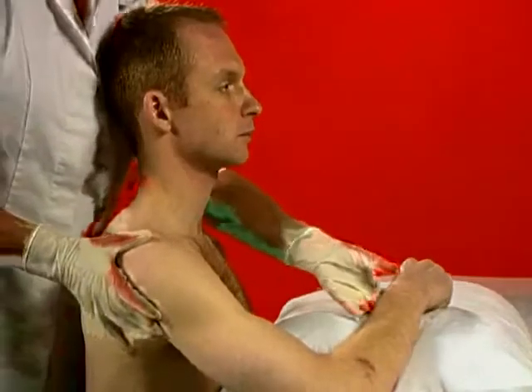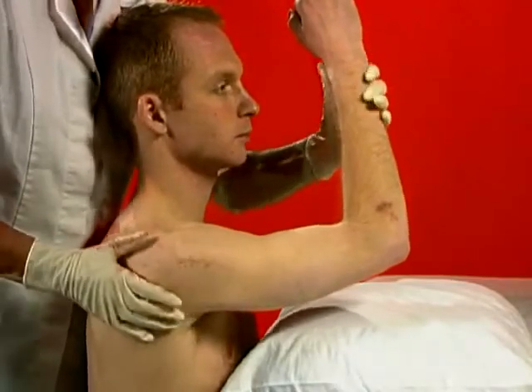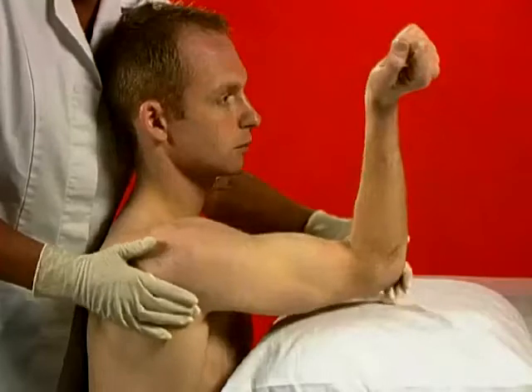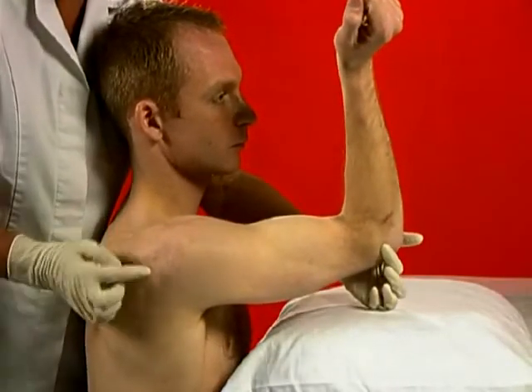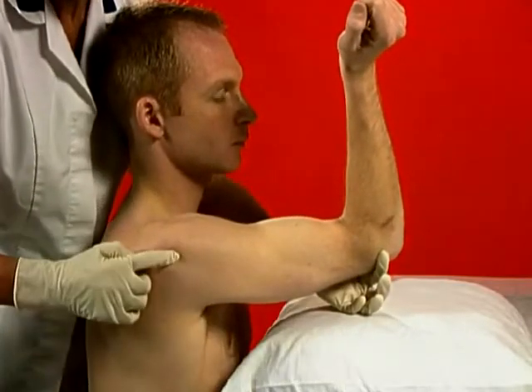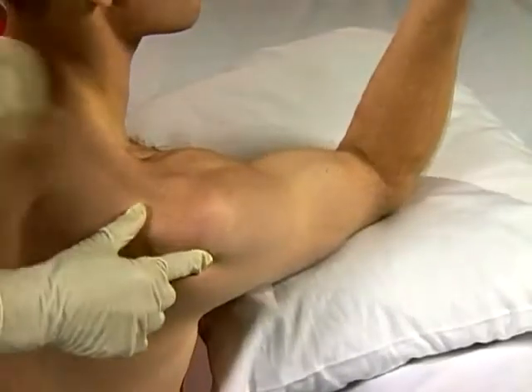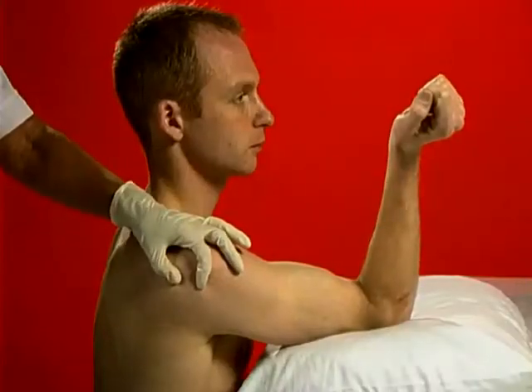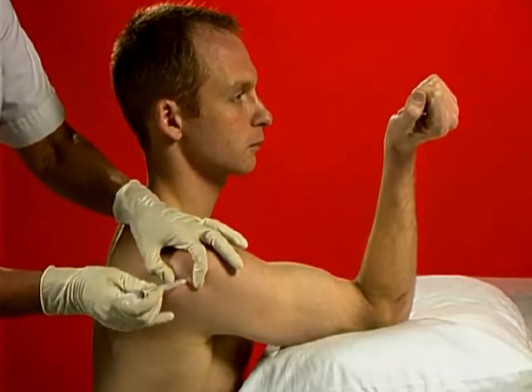Position patient with arm at 90 degrees of flexion, full adduction and full lateral rotation. Identify posterior angle of the acromion, which lies in direct line with the lateral epicondyle of the elbow. Palpate midpoint of tendon, approximately 2 fingers wide. Mark entry point, clean and firmly stretch skin, and rapidly insert needle perpendicularly into tendon. Aspirate and pepper into the enthesis.